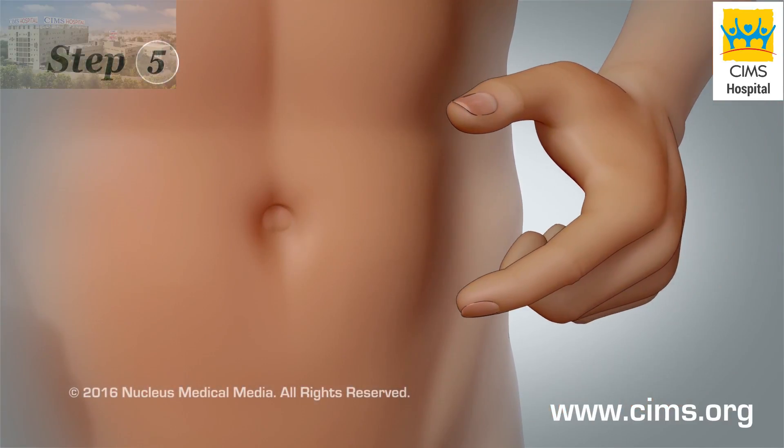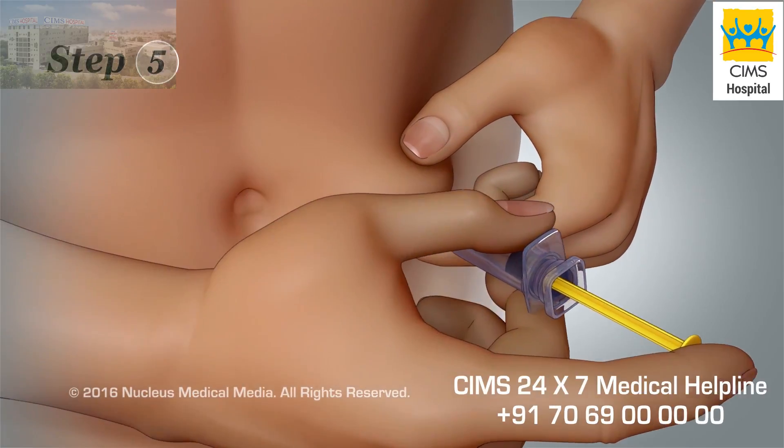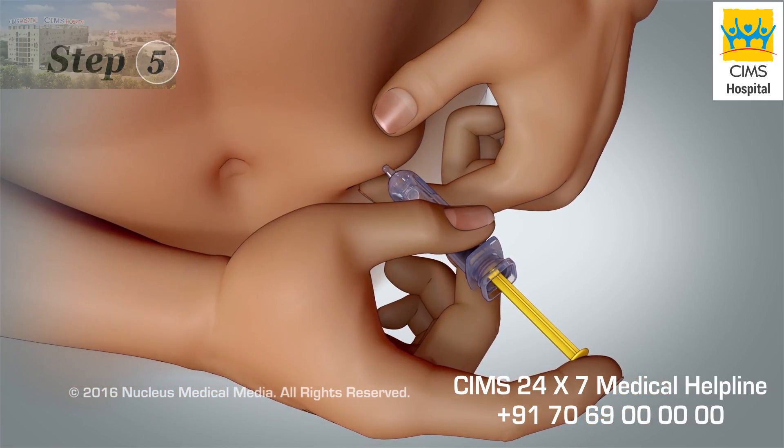Step 5. With your free hand, pinch and hold an inch of skin at the injection site. Insert the needle at a 90 degree angle through your skin and into the fatty tissue beneath it.